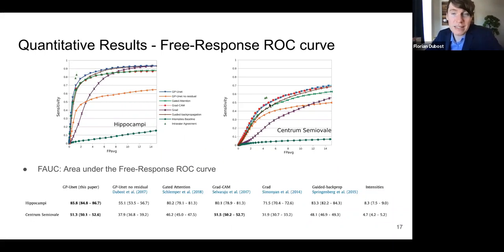But you see it actually comes very close to the intra-rater agreement. So we wouldn't expect to significantly overcome that, right? Because that's the maximum level of performance we can have to quantify enlarged perivascular spaces with those scans, or at least it's an estimate of it.